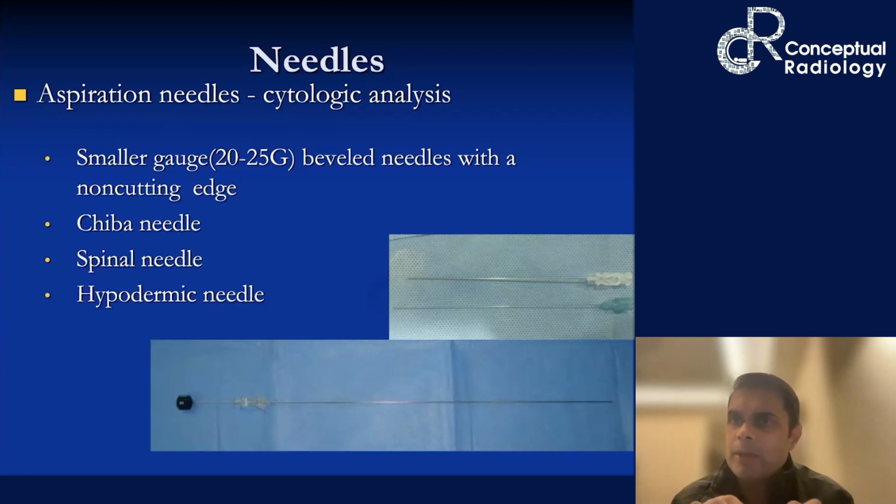They're thin needles. Because of it being thin, they are able to, with the suction effect itself, bring in some cells. So what you do is you go into that lesion and you try to puncture it multiple times, 8 to 10 times. You go through the lesion after seeing it in ultrasound guidance, and these needles help in pulling out some cells. These cells are not adequate to run major IHC tests, but this is just to give you a basic diagnosis. They are able to tell whether there's an infection going on. You can stain it with gram stain, you can stain it with AFB, or they can give you cells to tell whether it is an inflammatory process or a malignancy. So these are the kind of things you are able to pick up on FNAC.